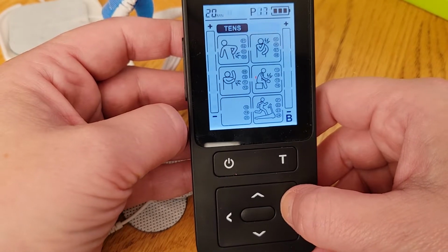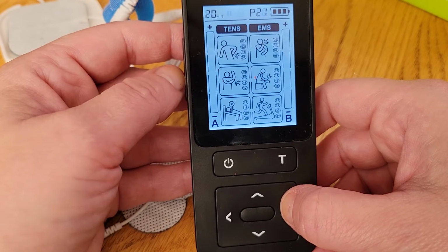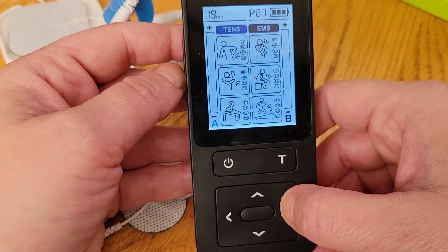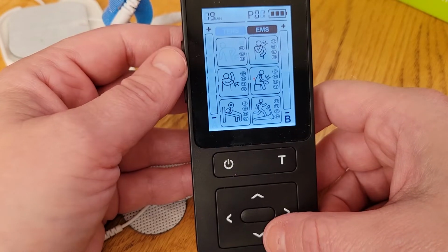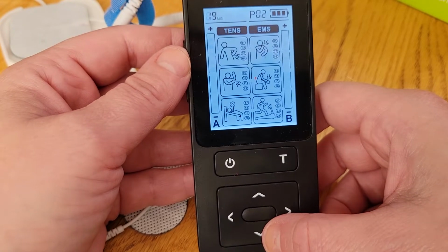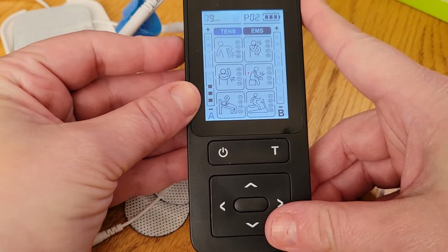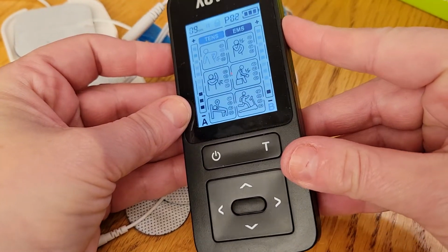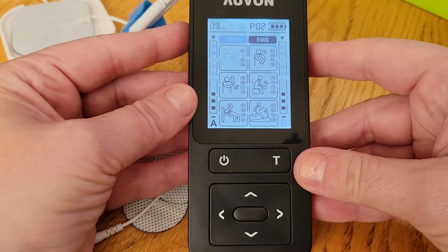These are the 6 major modes is what I would call them, and then there are sub modes in each one. And this number 1 is usually my favorite and the one I usually go with, but there are some other ones. Let's say you wanted to do 2, then you would simply click on this, and then turn it up on this side. And that's basically how you use it.